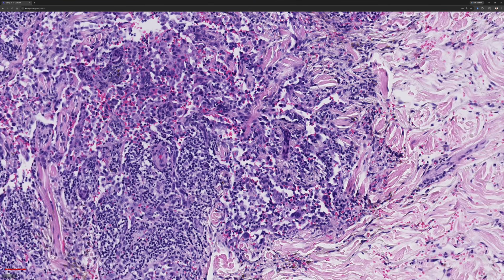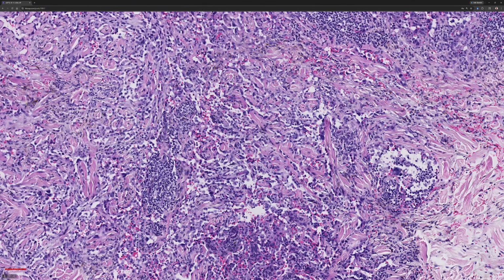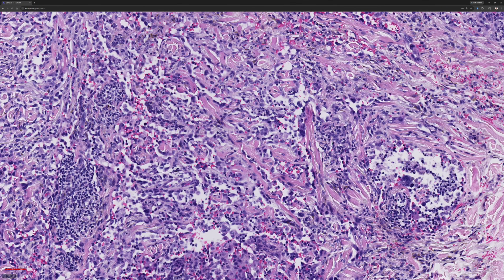Very good. Angiosarcoma. There are a lot of different patterns in angiosarcoma, but some of the classic things are interconnected, infiltrative, anastomosing channels, that is kind of the buzzword, and that's exactly what we're seeing here. All these channels, if this was a lake and you had a boat, you could go from this channel down here almost all the way across the slide without hitting too many roadblocks, right?